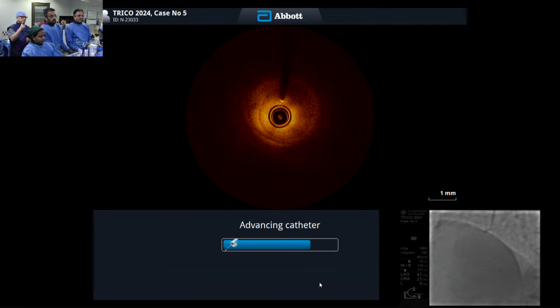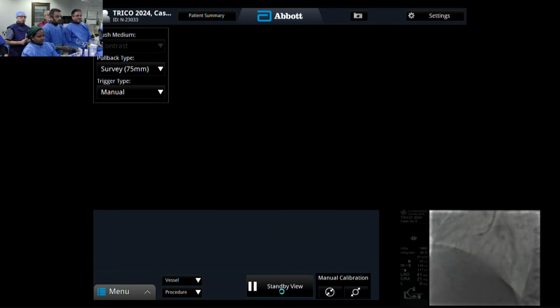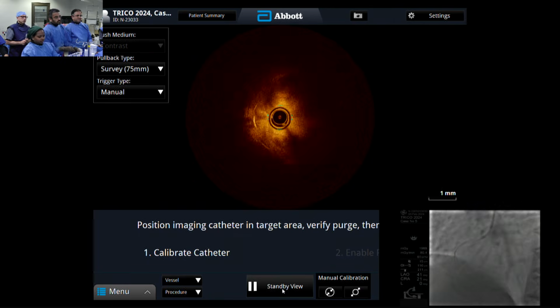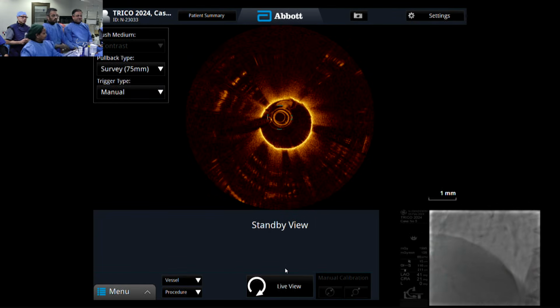Oh dear, we got a little mangled there. Why get entangled? The wires are tangled, so remove everything. And I can rewire it probably. Yeah, there we go. That's better. PLV is a better branch for OCT.